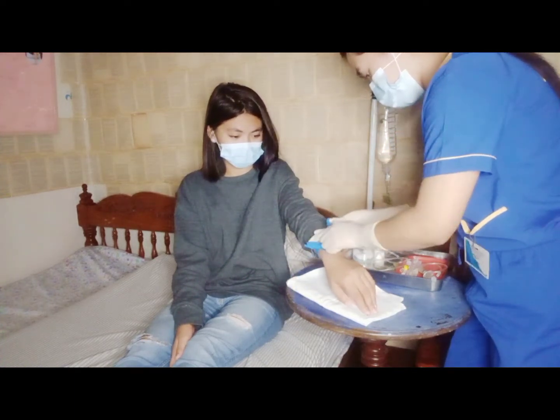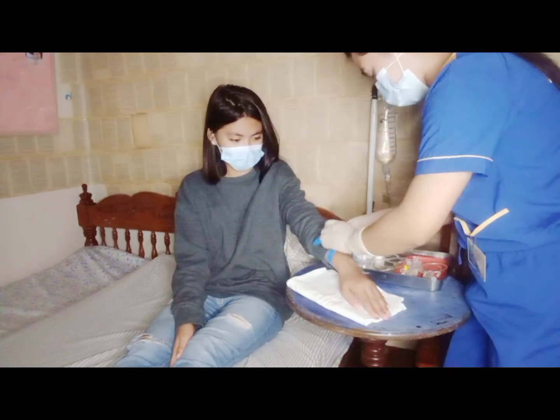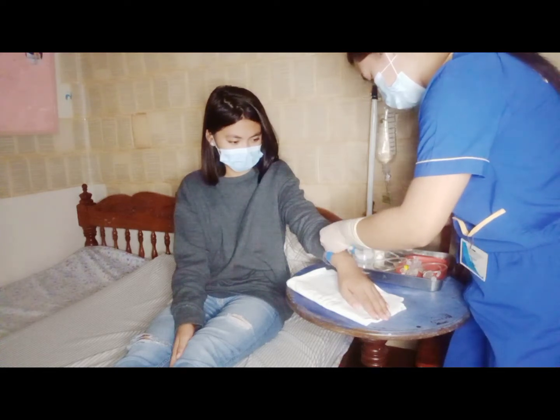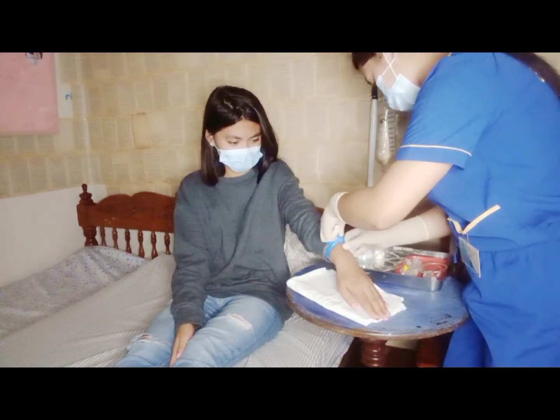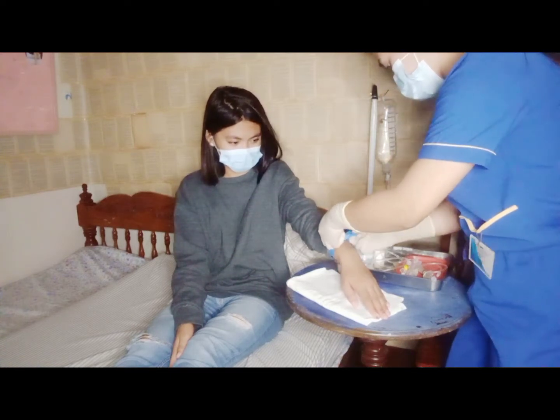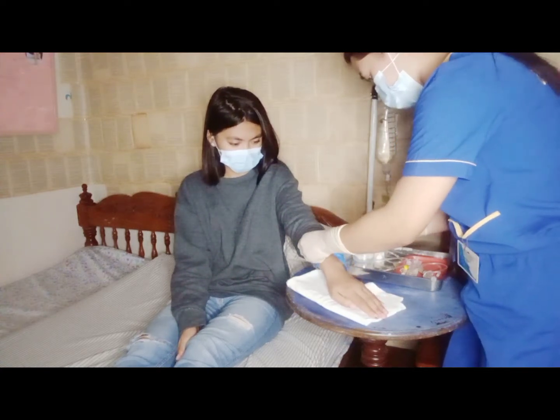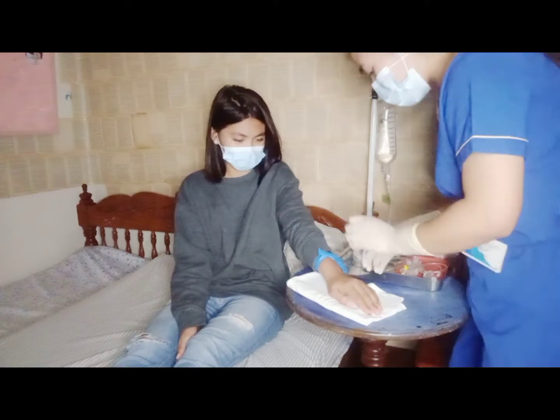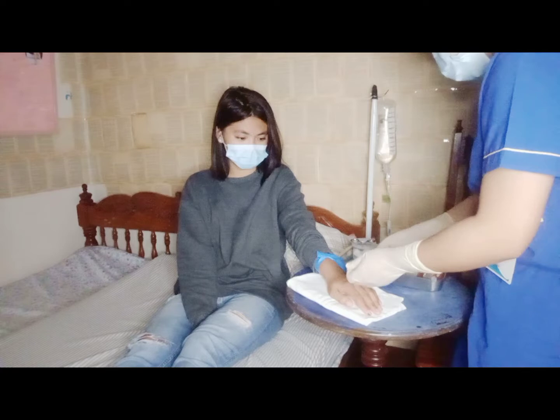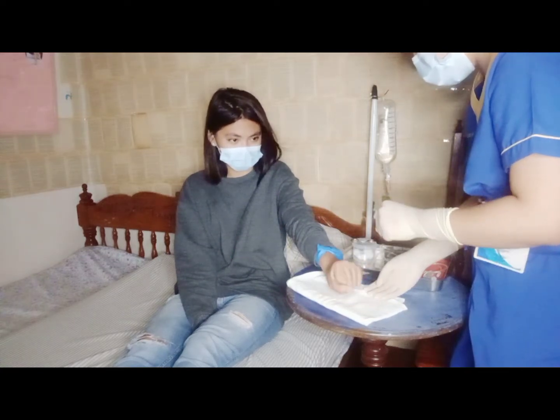Kaba po muna, ma'am. Kamay. Relax mo lang po yung kamay mo, ma'am, ha? Okay po. So, lagyan kita ng ganyan, ma'am, para makita ko yung vein or yung ugat na tutusukan ko. Okay? So, try mo nga pong i-close and open yung fist mo.